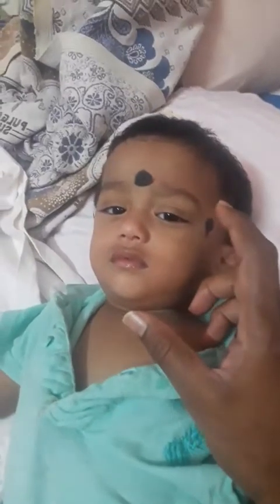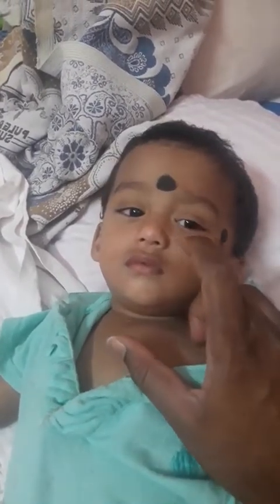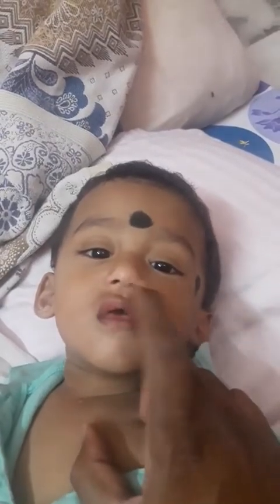Now, these eyebrows are optic nerves. Eyes are LOCR. And cheeks are paraclival carotids, like this. Mouth and nose are the pituitary. So, the first thing after removing the sphenoid keel, you have to look at baby's eyes.